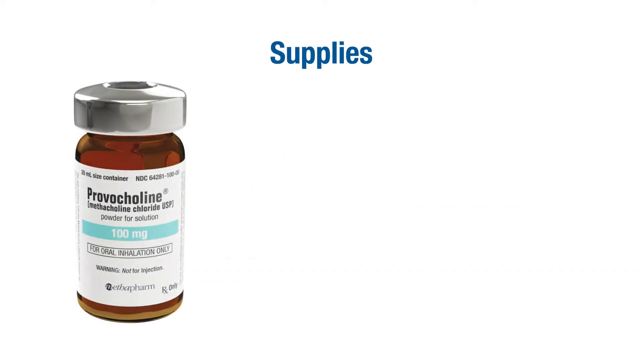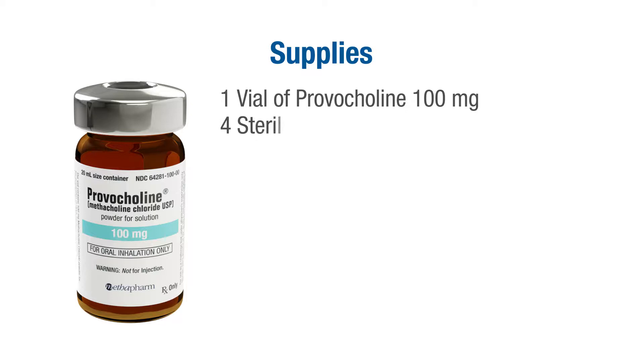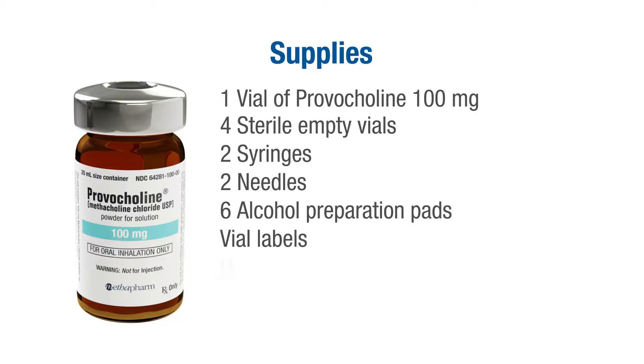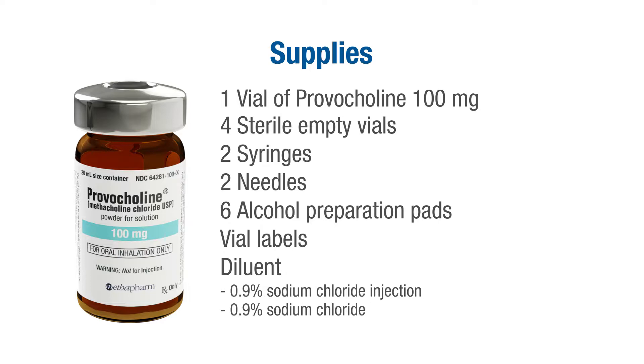To perform this dilution you will need one vial of Provocholine 100 mg. This is a sealed vial to allow for easy reconstitution and to reduce your exposure to the product. You will also need four sterile empty vials, two syringes, two needles, six alcohol preparation pads, vial labels, and diluent. Provocholine is approved for reconstitution with 0.9% sodium chloride injection and 0.9% sodium chloride injection with 0.4% phenol.